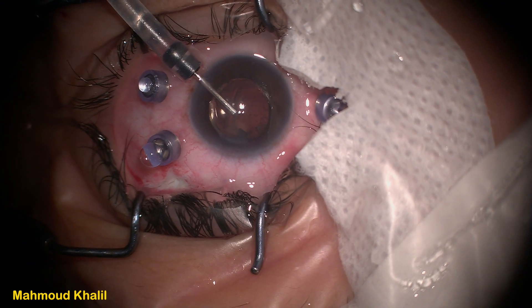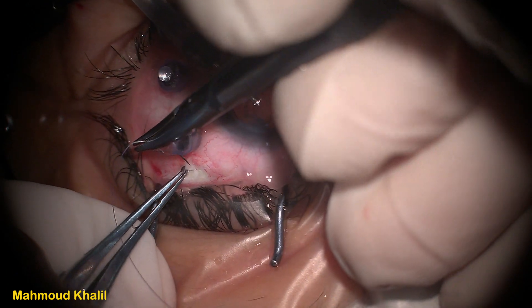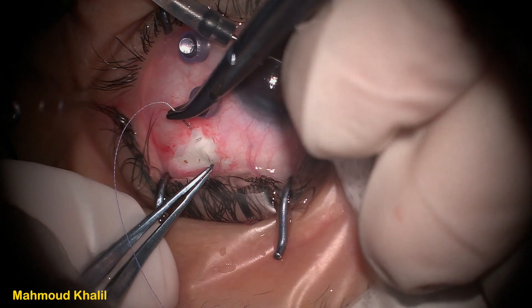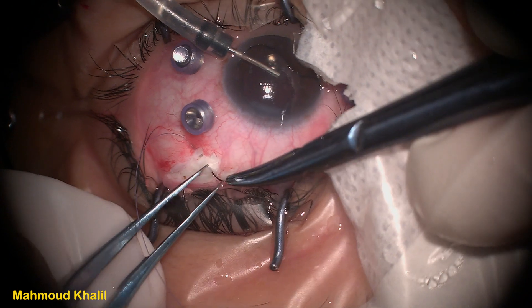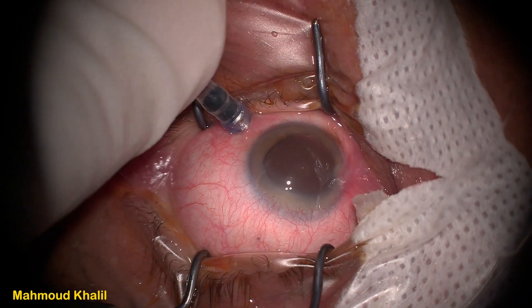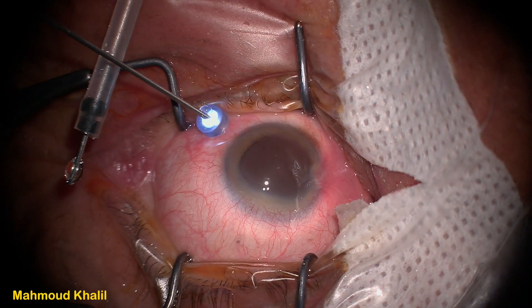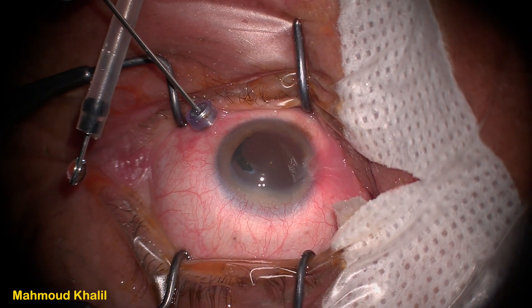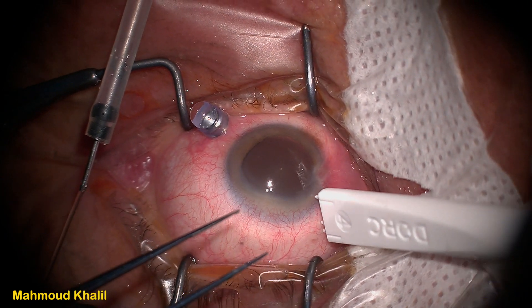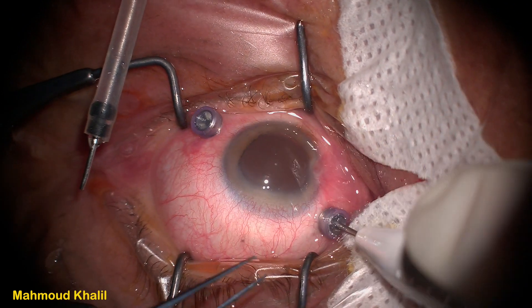In this case, when I placed the inferotemporal trocar I found the infusion cannula was not reaching inside the eye. So I decided to place the infusion cannula inside the anterior chamber as an AC maintainer, performed outside drainage of the choroid, and then sutured it. After draining the choroid, I placed the infusion cannula back inside its inferotemporal trocar. In another case, while checking the infusion cannula inside the eye, I could not see it clearly, so I decided to remove it and place the light probe inside the trocar instead. We can see it moving smoothly into the vitreous cavity completely.